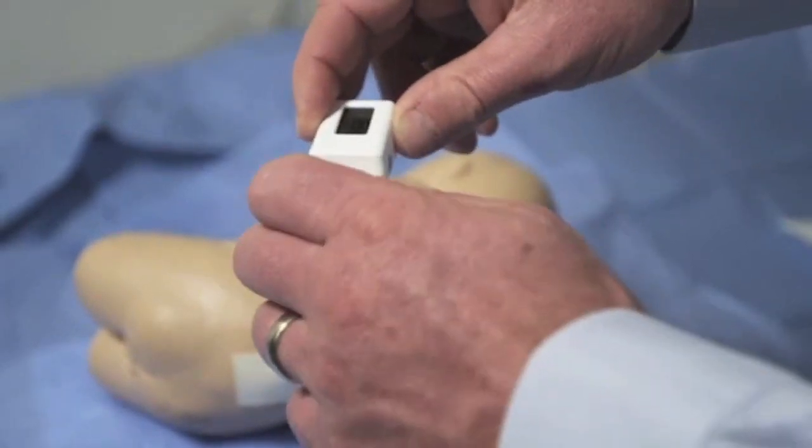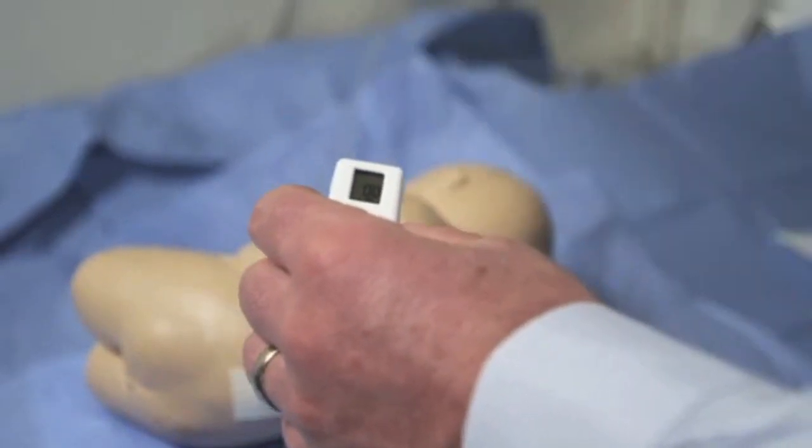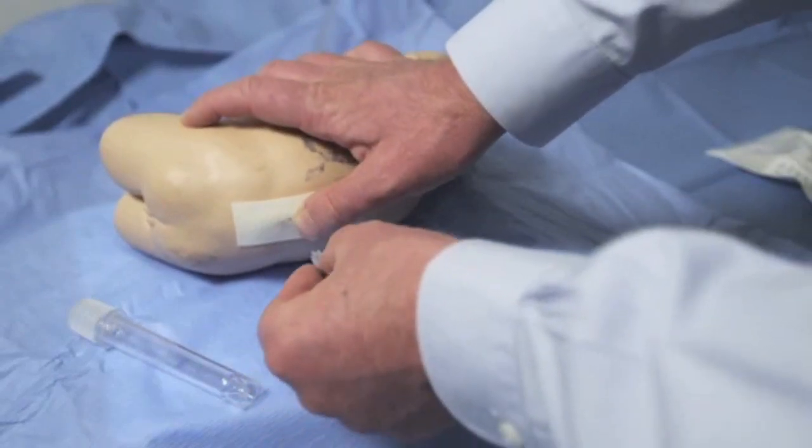Remove the rear cap of the device to facilitate the procedure. Start by inserting the needle with the stylet.